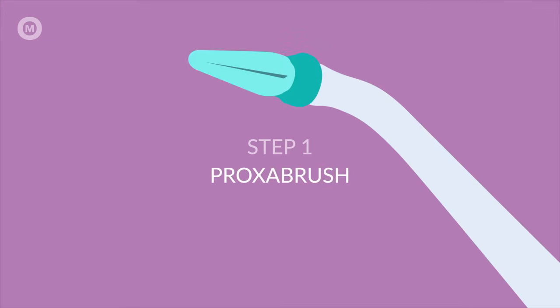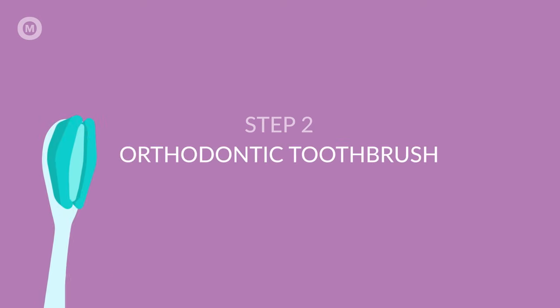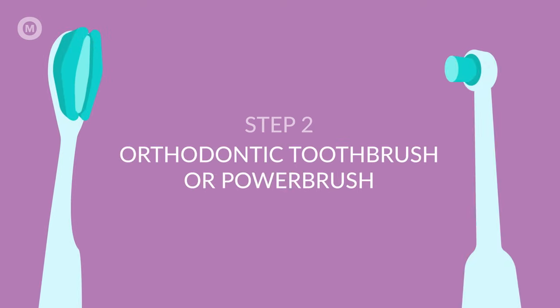Start with a Proxa brush to remove chunks of food that are stuck between your teeth and braces. The next brush you'll need is either a manual orthodontic toothbrush or a power brush.